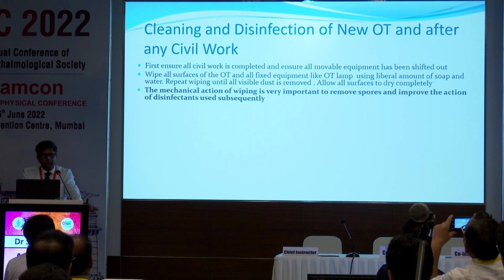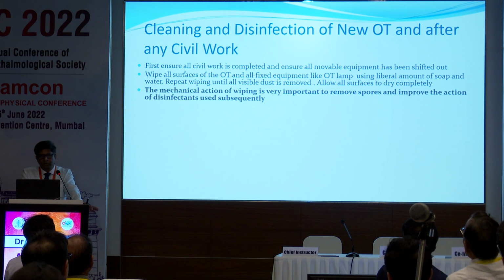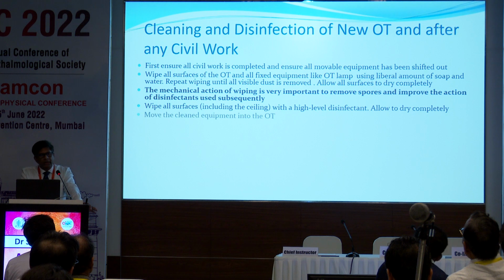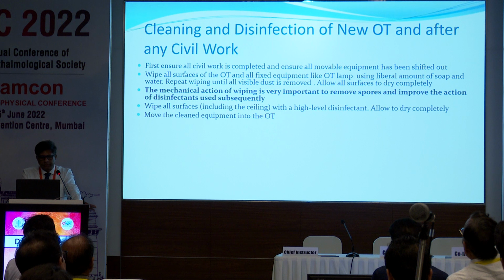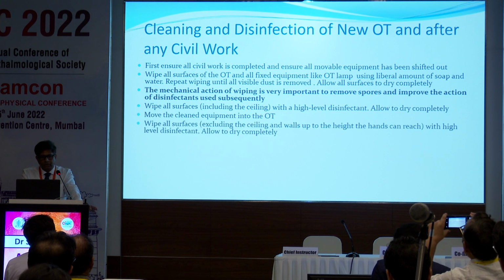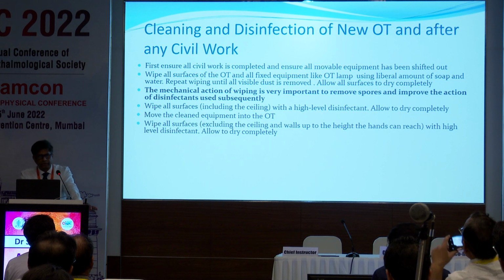This mechanism of wiping actually is very important to remove the spores and improve the action of the disinfectants which are used subsequently. So the next step is using disinfectants, and with the disinfectants all the surfaces are wiped again and allowed to dry completely. Then the equipment which was moved out and cleaned outside is moved inside the OT, and the wiping is repeated again, and then it's allowed to dry.